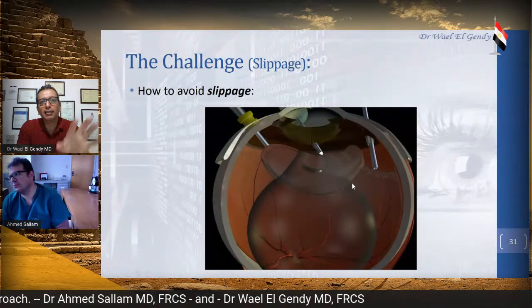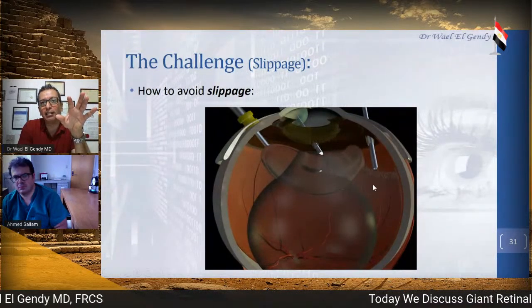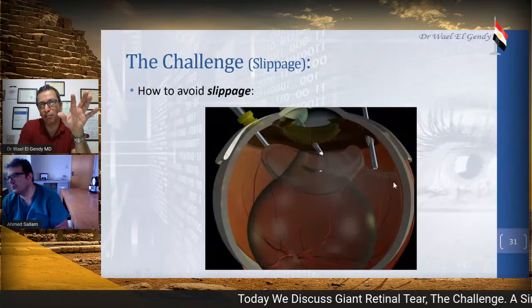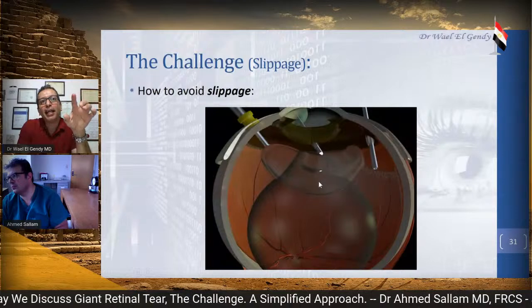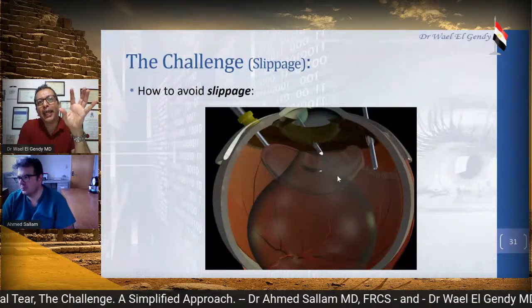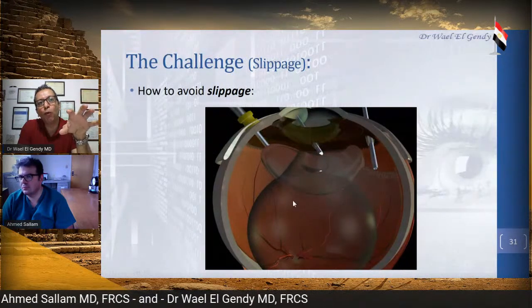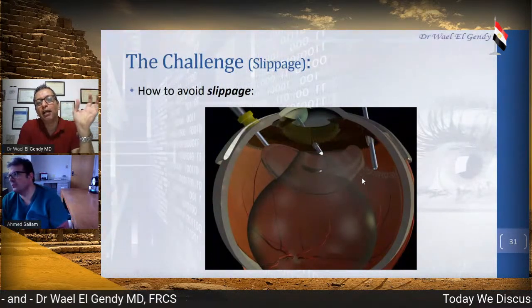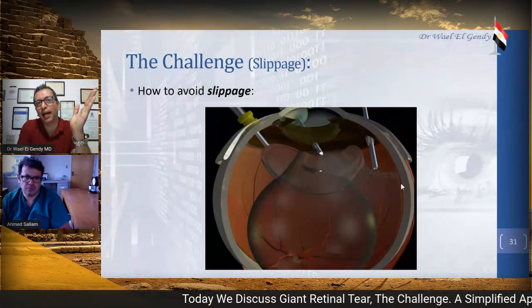Of course, this image is exaggerated. This space is exaggerated; it's a small space, but it shows you that the silicone gets in touch with the PFC, and they become one unit and kick the fluid out to the side.